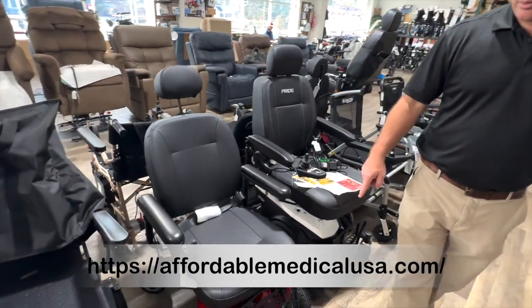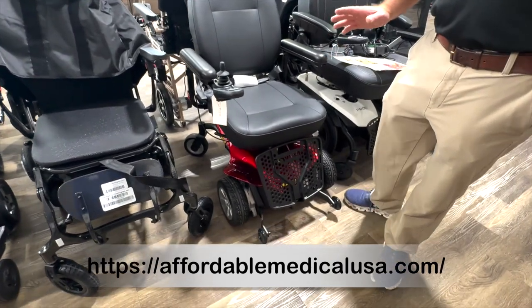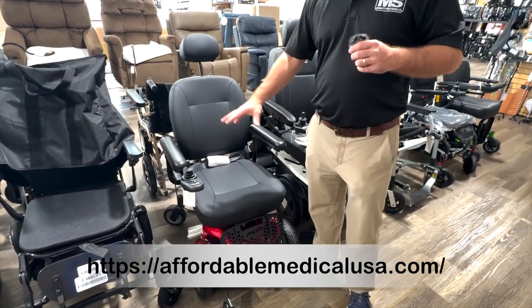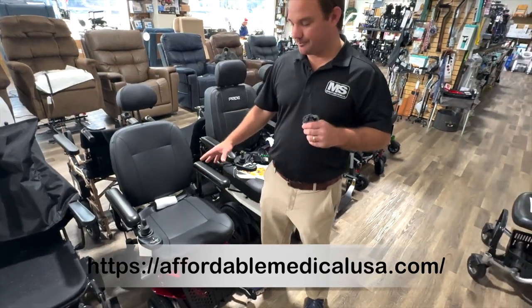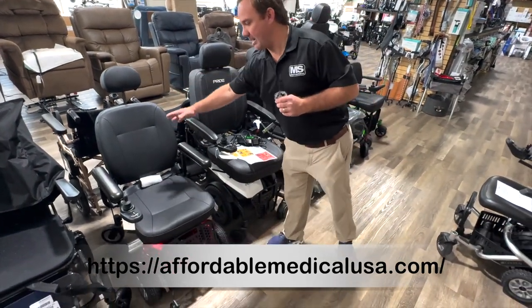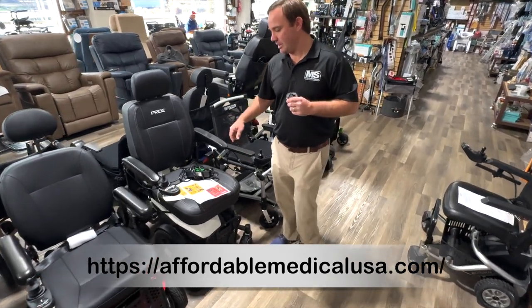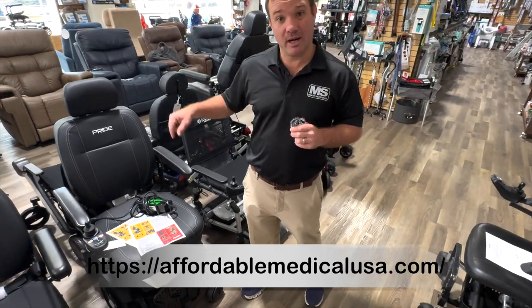The Cricket is a front-wheel-drive power wheelchair — good for inside your house and to get over some thresholds, because the front wheels are at the front. This is a full-size chair. It doesn't really come apart but it's got a high back and an adjustable seat. This is an awesome chair. This is the EVO with the lithium battery bricks.